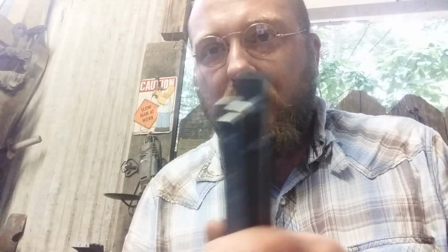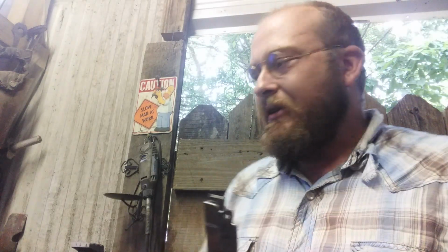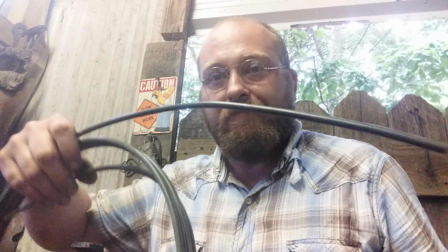Well, I mocked them up with a little nuts and bolts to see how they would feel, and it's extremely heavy. That will not do. So I've been looking around my illustrious scrap heap, and I found a roll of hard steel brake line. This whole roll probably doesn't weigh as much as this pile of steel, and keeping the weight to a minimum, I think, is one of the essential elements of this project.